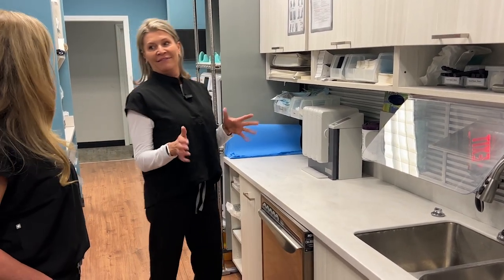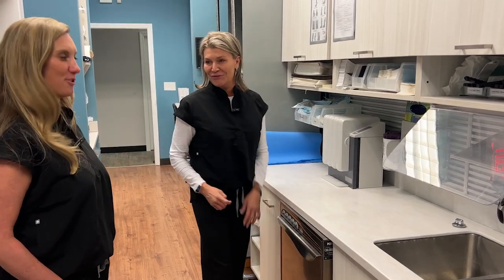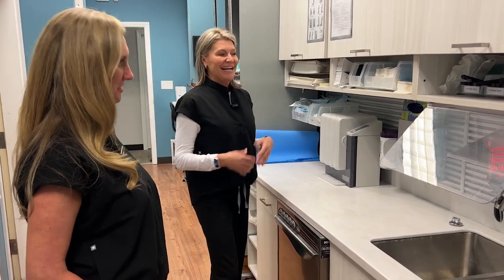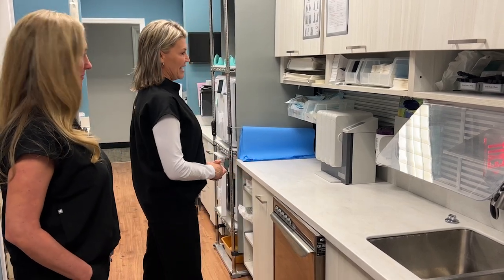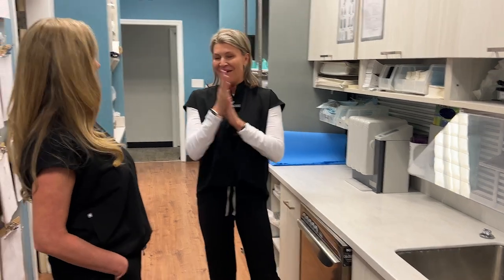We've thought of everything. We don't make things on accident — it's all very well thought out. I'm excited for Dr. Todd and Dr. Jason to get this in the office. They'll love it.